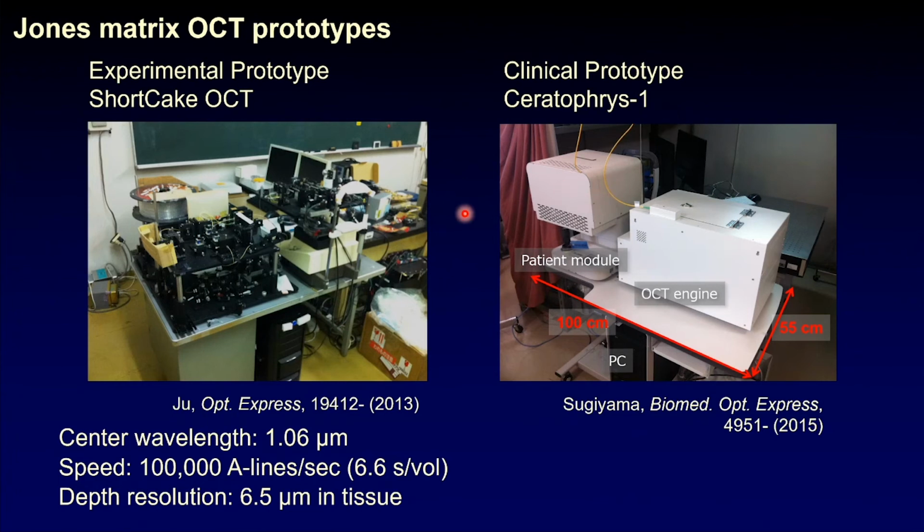And the point is, this system is workable in a clinic without operation engineers. This means someone who is not trained for OCT development can operate it. So this system can work stably in the eye clinic, and it has been working in reality.